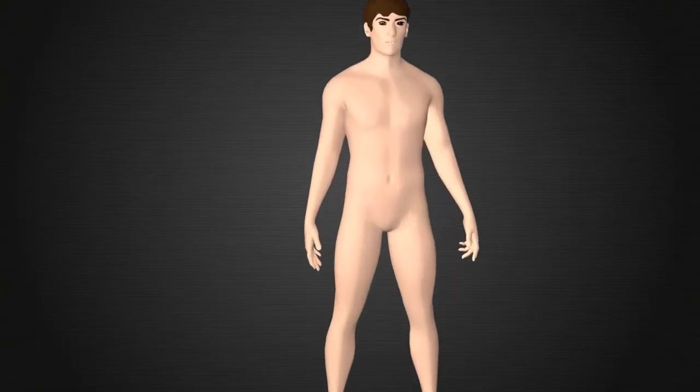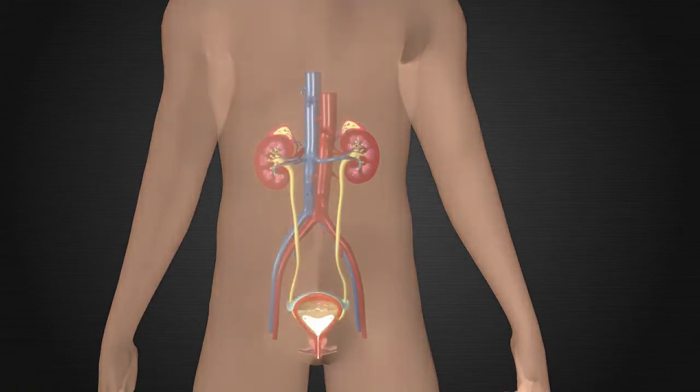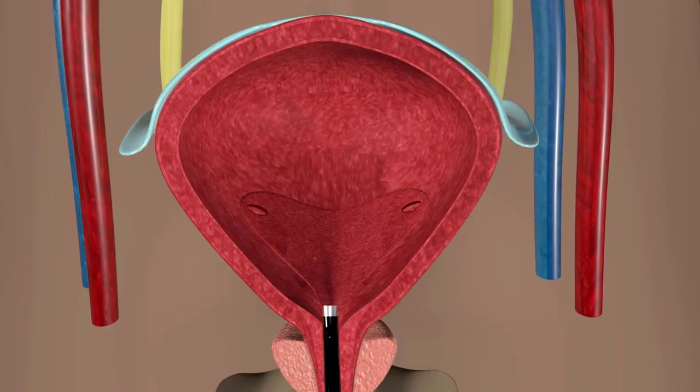In order to remove your stone, we will need to perform a procedure called ureteroscopy. First, we will use our cystoscope to get access to your bladder. We will enter your bladder from your urethra, which is where you pee from. There will not be any cuts on the outside of your body. Once we are inside the bladder, we will find the opening to your ureter, which is the tube that drains urine from your kidney to your bladder.